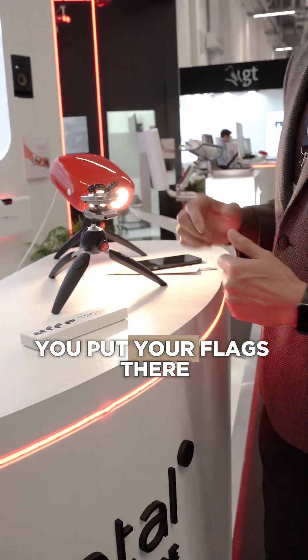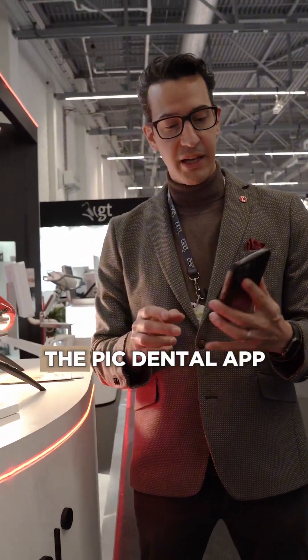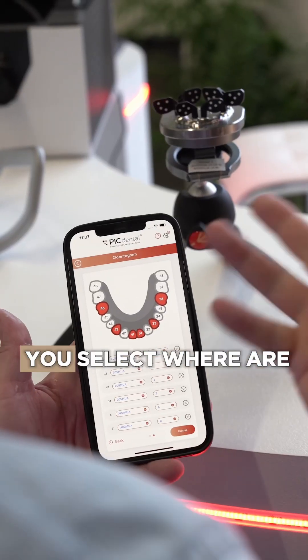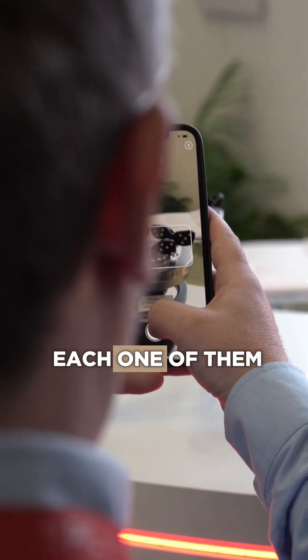You just have your patient, you put your flags there, and then you just need this app — the PIC Dental app. You select where the implants are, put your flags. Of course, there's a code over each one of them.